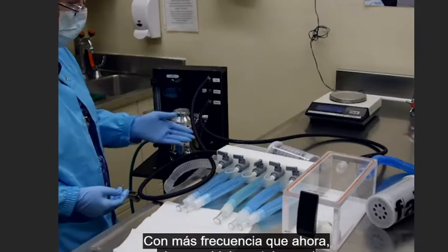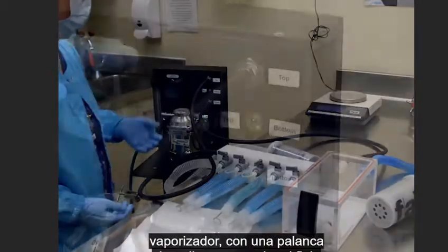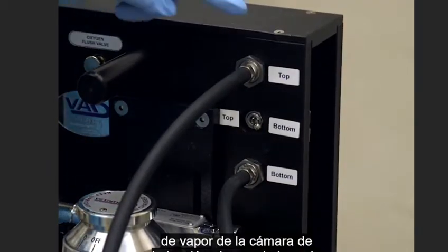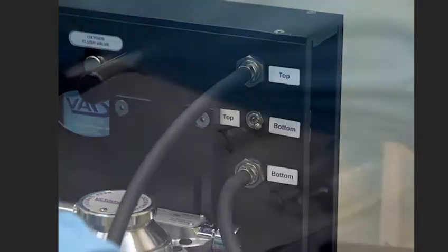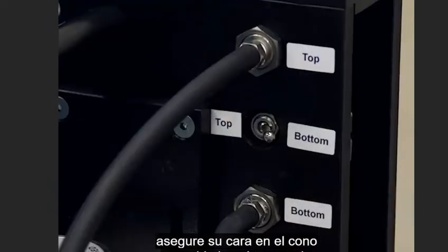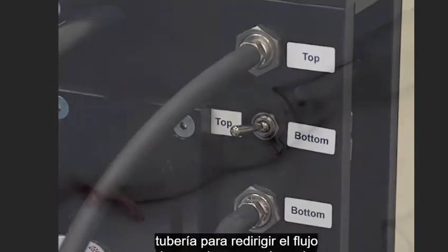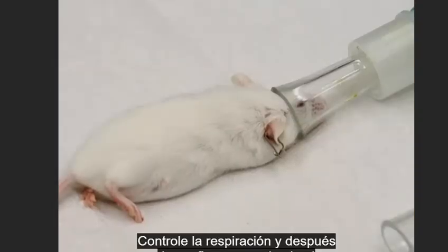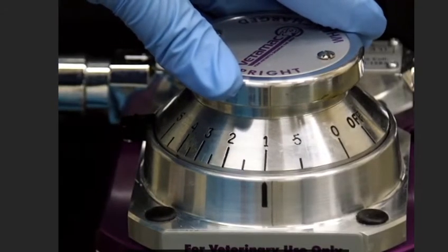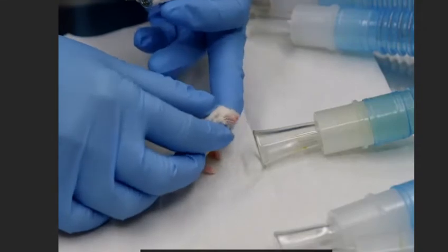More often than not, the assembly is such that the cone and the induction chamber are both connected to the same vaporizer, with a toggle in between to switch the anesthetic vapor delivery from the induction chamber to the nose cone and vice versa. After anesthetizing the animal in the chamber, secure its face in the cone and switch the toggle on the tubing to redirect the gas flow to the nose cone. Monitor the respiration and, after confirming that the animal is relaxed, reduce the anesthetic to a maintenance level of 0.5 to 1.5 percent. Also apply ophthalmic ointment to the eyes to prevent corneal drying.